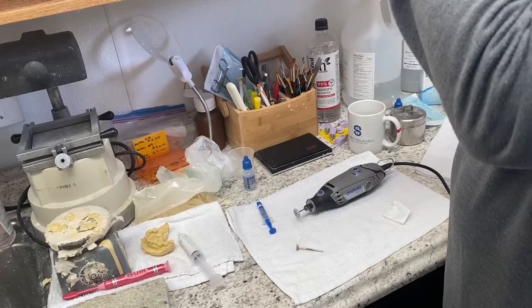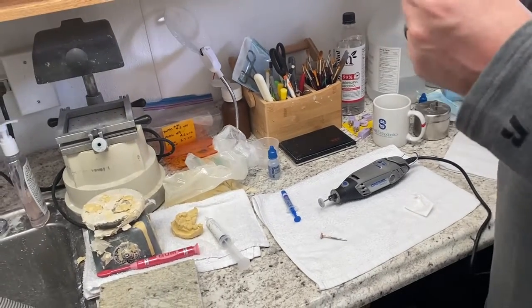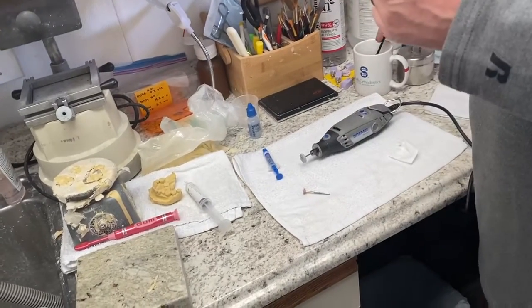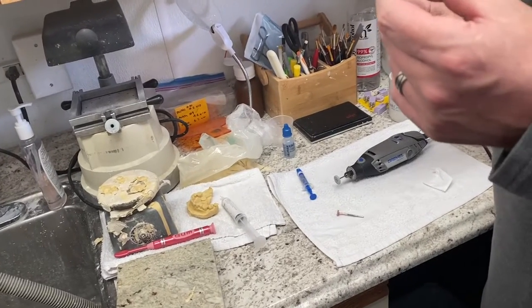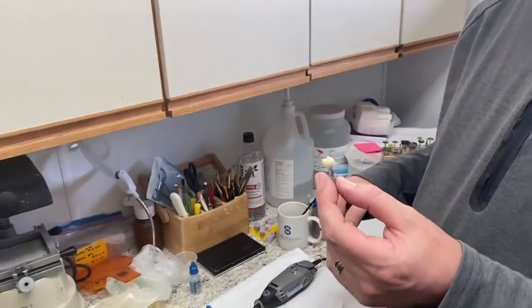Because the oven is going to burn anything that goes in there, and all those impurities make holes in the crown. Oh, they make holes. Yeah, they don't make holes going through the porcelain. They make holes in the glaze, and that makes the glaze real rough. Also, it takes away the clarity and the shininess. It's like craters on the surface of the glaze.